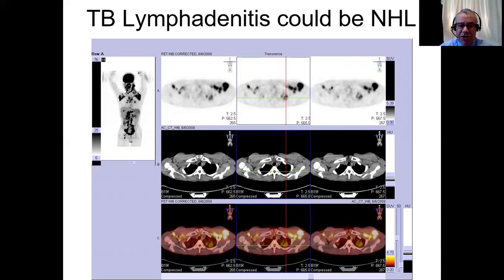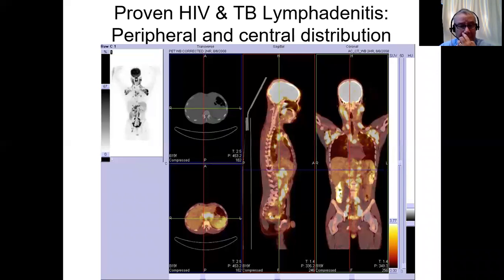And therefore, in this patient, despite the fact they've got lots of lymph node disease, you may be much more likely to call that at least some of these could be due to TB. The problem, of course, is that the lungs might be due to TB and the nodes could still be due to lymphoma in an HIV positive patient. So it's still not possible to say exactly the cause.